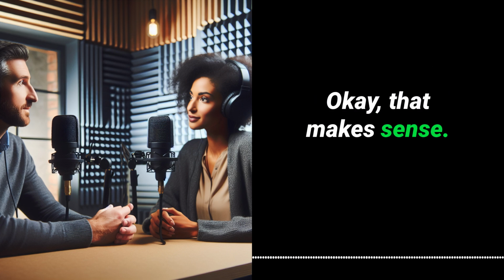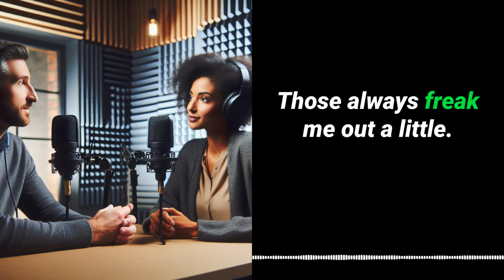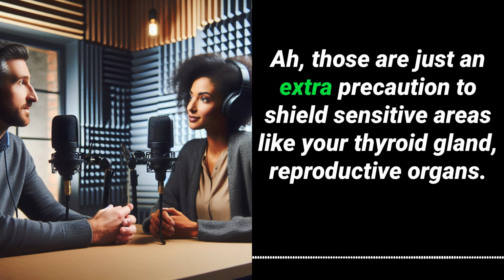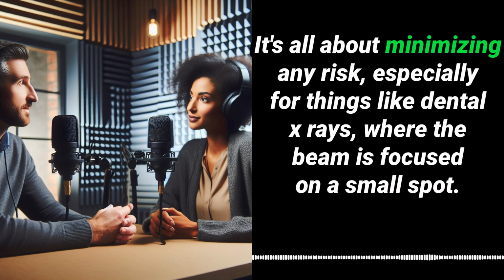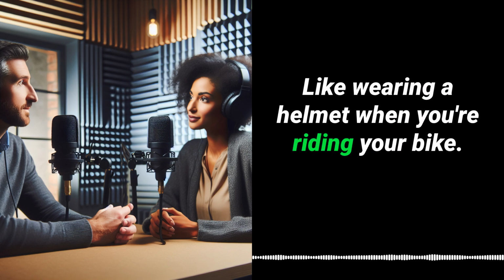Okay, that makes sense. But what about those lead vests at the dentist's office? Those always freak me out a little. Those are just an extra precaution to shield sensitive areas like your thyroid gland, reproductive organs. It's all about minimizing any risk, especially for things like dental X-rays, where the beam is focused on a small spot. So better safe than sorry. Like wearing a helmet when you're riding your bike.